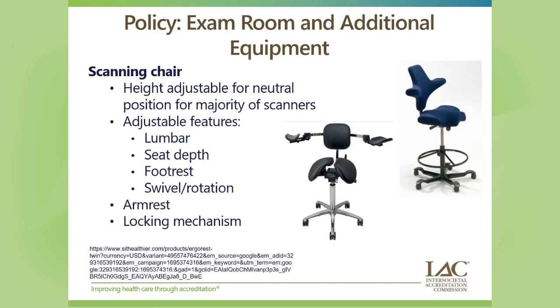A footrest is encouraged, and again, that helps with bed height or console height, being able to find that balance and ensure that our legs are at more of a 90-degree bend, so that we're not putting extra pressure on our low back, and maintain a more neutral position for our legs throughout the exam.